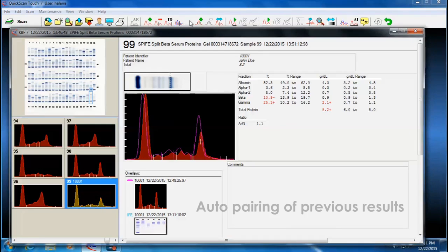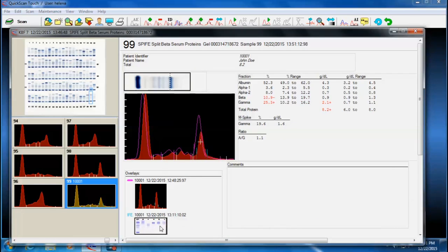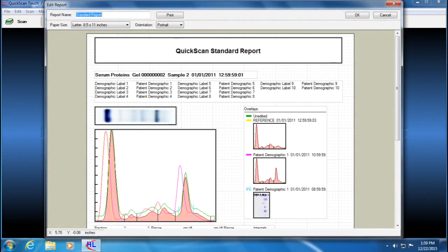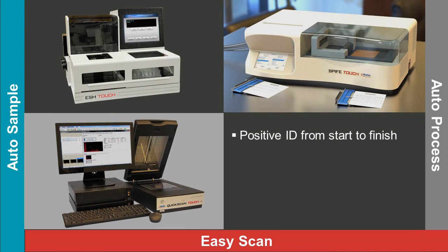New patient results are automatically paired with the patient's previous results from the QuickScan data store to help a clinician monitor treatment progress. Up to 200 previous results can be viewed. Printed reports are fully customizable. Work lists from the EschTouch can be downloaded to the QuickScan Touch for efficiency and positive patient ID from start to finish.